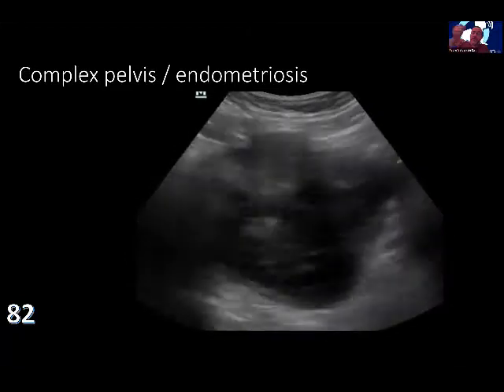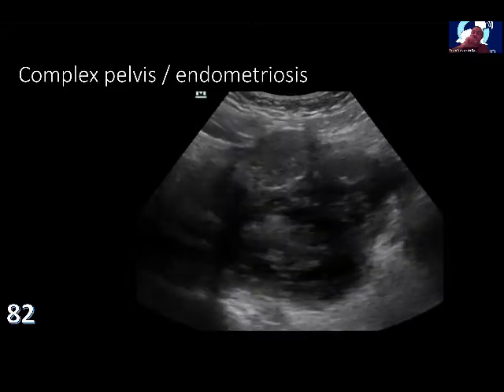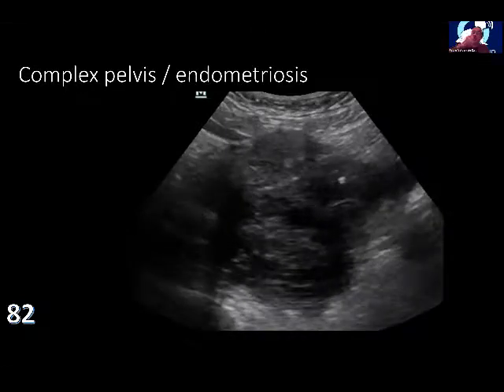If we bounce a bit or squeeze or move, or use the transvaginal approach, and everything moves or doesn't move, or everything moves in a block, that means if they get into surgery, they will have a bad time trying to fix that.